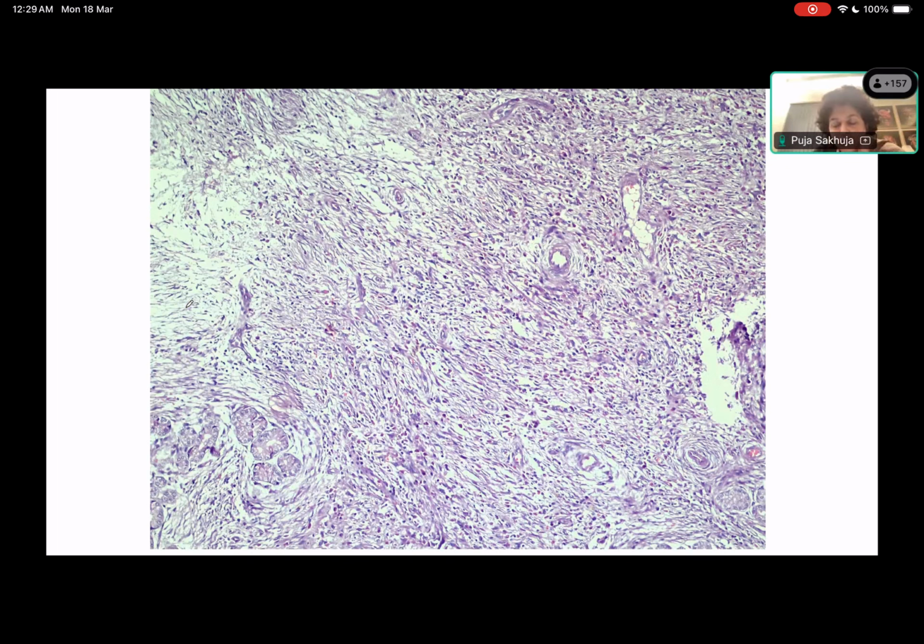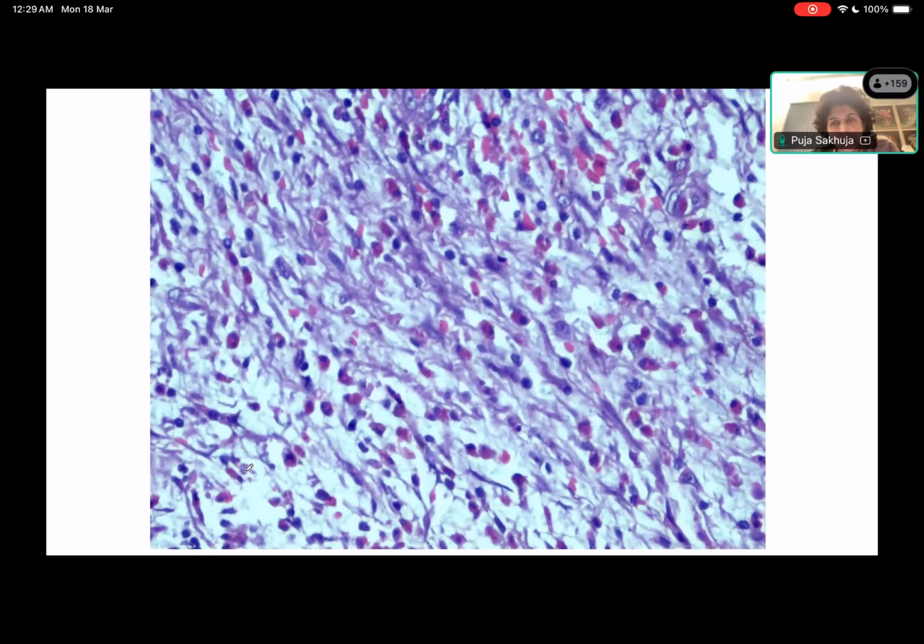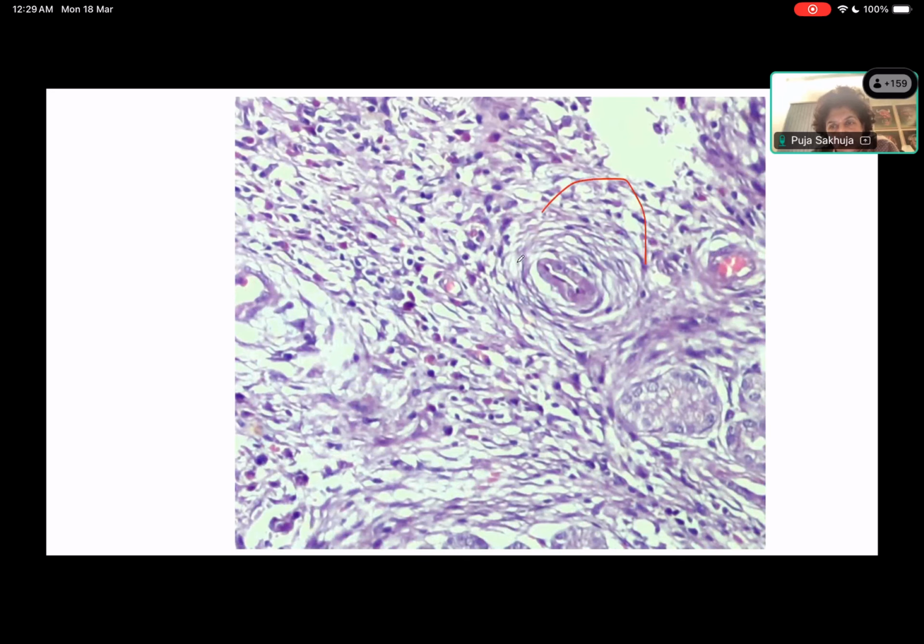Inflammatory fibroid polyp. So two of the very typical features that you have seen are the presence of eosinophils and the presence of this concentric whirling around the blood vessel, and this can also occur around the gastric pits. Okay, so it can occur in both regions. And what should be our further approach? This is a high power to show you the eosinophils and the concentric whirling around the blood vessels and glandular component.